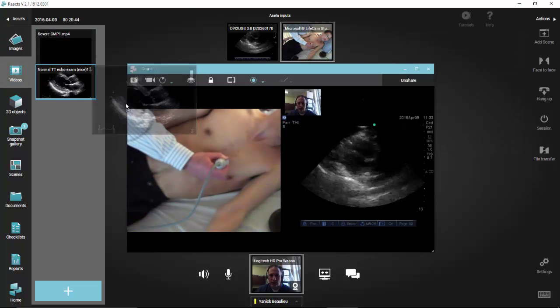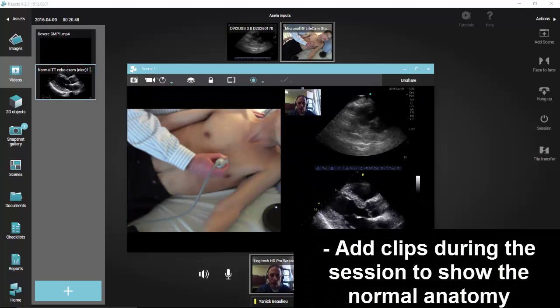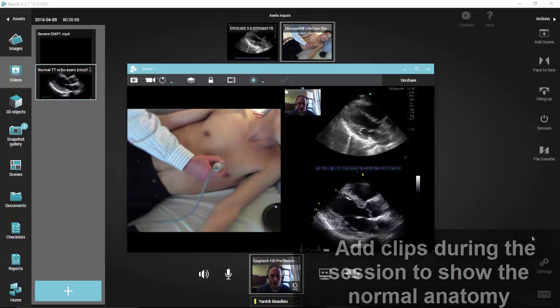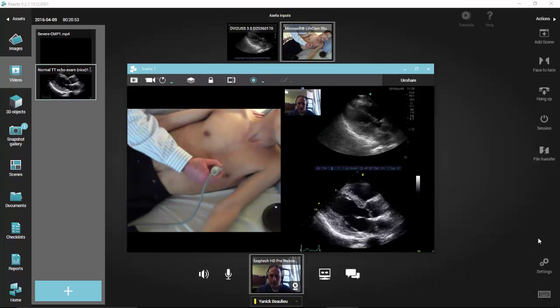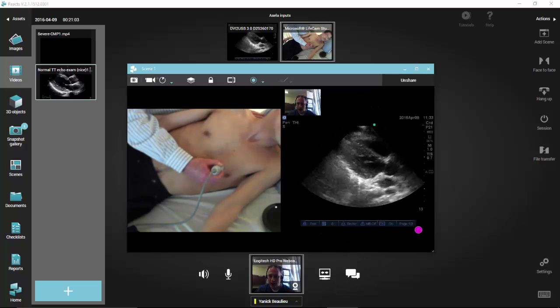So what I'll do here is I'll place right under your image. You will see a normal parasternal long axis view. Is that better there? That's perfect. So you can see now that your image is getting nicer. You have a better acoustic window. So let me make that normal image go away as you're getting it.